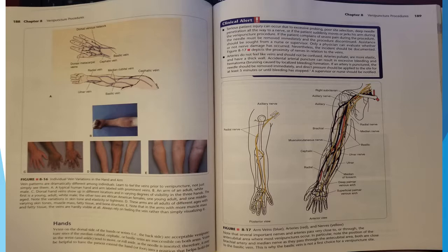Hands. Veins on the dorsal side of the hands or wrists are acceptable venipuncture sites if the median cubital, cephalic, or basilic veins are inaccessible on both arms. Veins in the wrist and ankle tend to move or roll aside as the needle is inserted. Therefore, it may be helpful to have the patient extend the hand or the foot into a position that helps hold the vein taut.